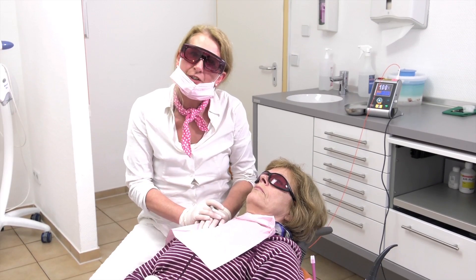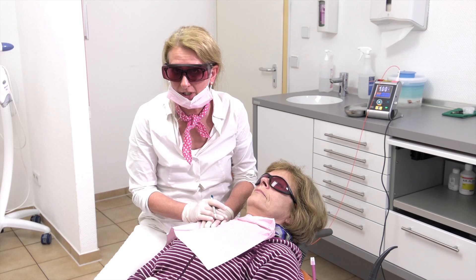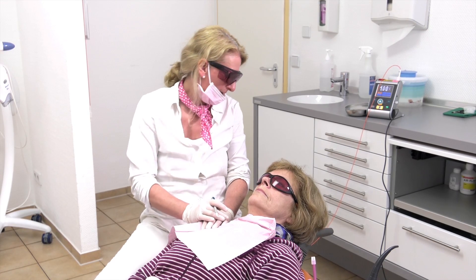So, this is Irita. She hasn't got herpes, but she came around to show you the treatment. And I will start.